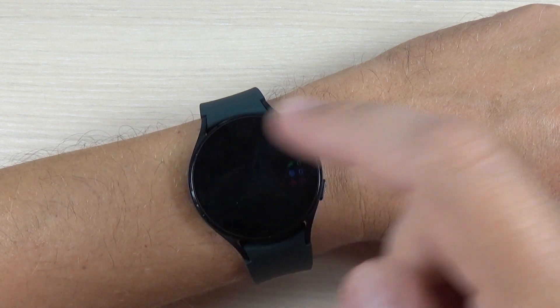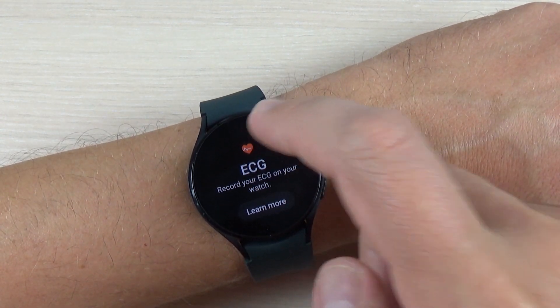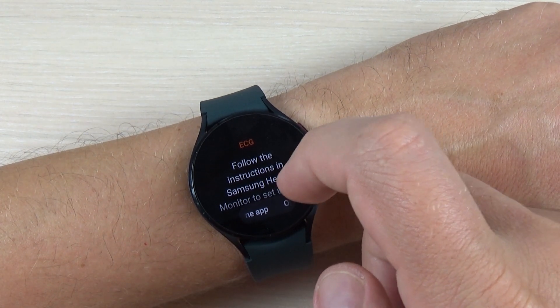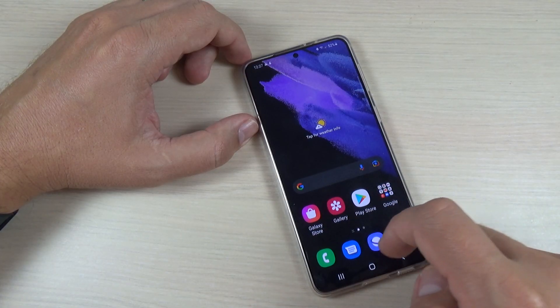First, swipe to the right and go to ECG measure. Press 'Learn More' and follow the instructions in the Samsung Health Monitor to set up your watch. Here is my phone.